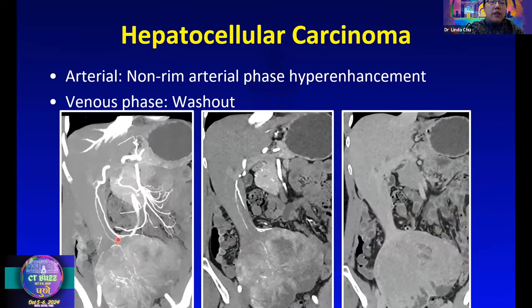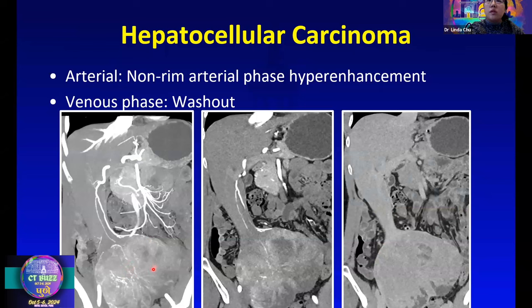Here's another example of an HCC. On the arterial phase, it has very heterogeneous arterial phase hyper-enhancement. The MIP image on the left helps bring out the very disordered tumor neovascularity — you can appreciate very irregular feeding vessels in this mass, which is also a sign of malignancy. On the venous phase images, there is washout, checking all the boxes for a hepatocellular carcinoma.